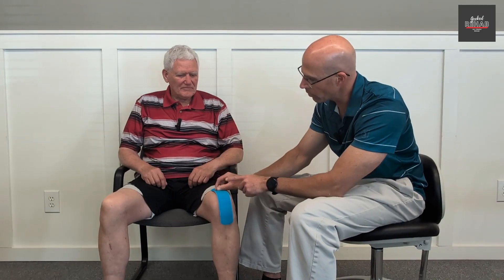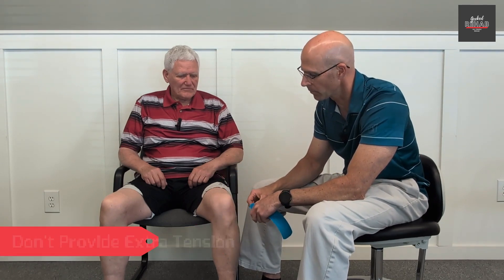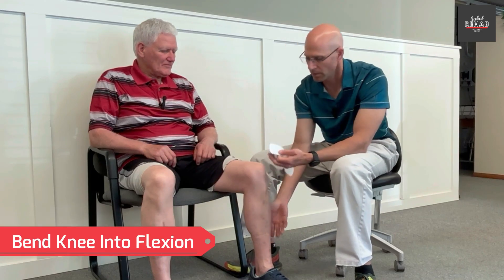I went ahead and pre-cut this. You want to go up a little bit on the quads and make sure it comes over the kneecap and just a little below. You want to apply this with 10% tension, which is basically just pulling the paper off and applying it at that same tension — it's on the paper with about 10% automatically — and just go straight over the patella in a flexed position. Doug, let me have you bring your foot back just a little bit more. Perfect.